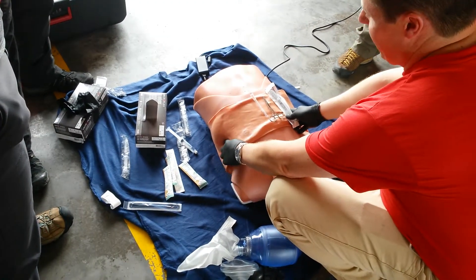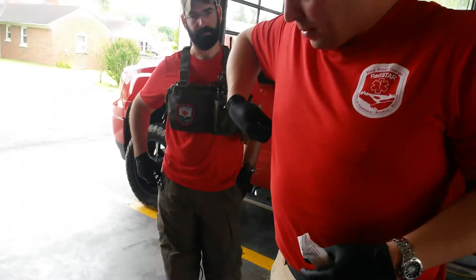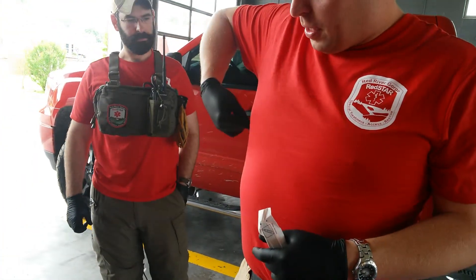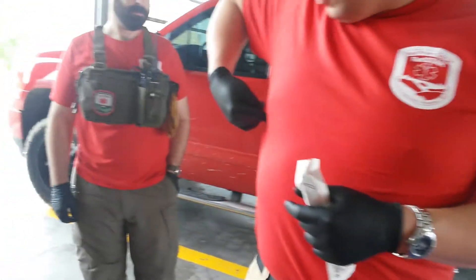It's fairly simple. You find the same spot that you probably would have stuck a needle into, so kind of into your axillary line, fourth or fifth intercostal space, somewhere around here. Kind of slide over, and it'll be somewhere right in there.